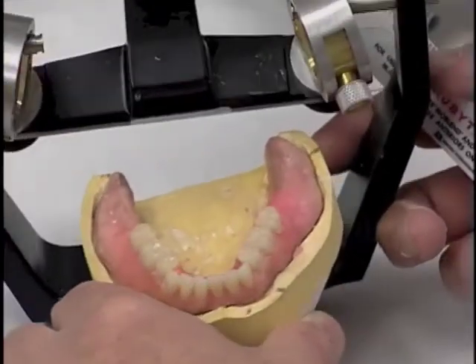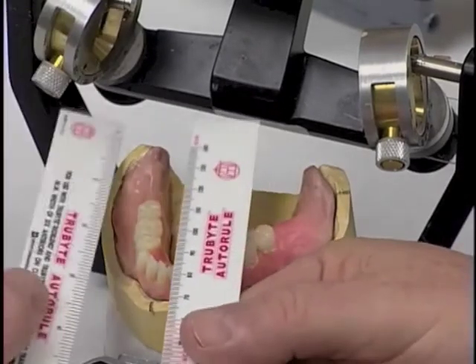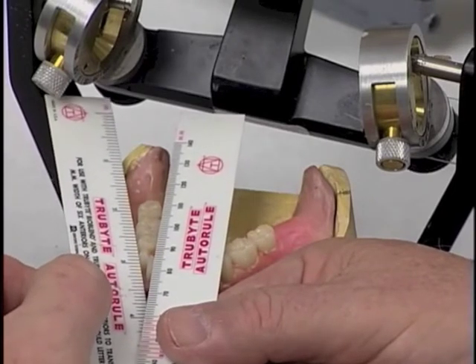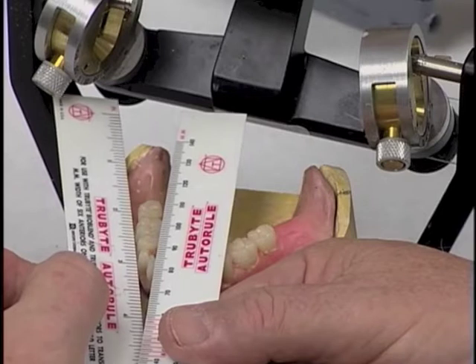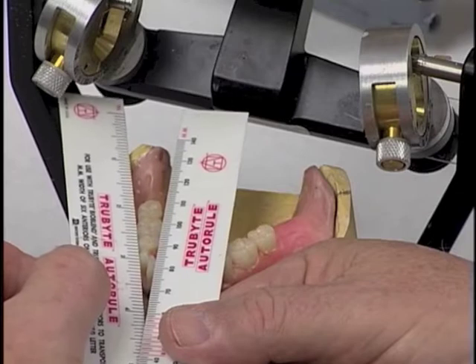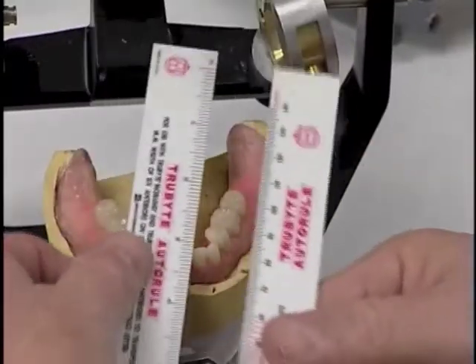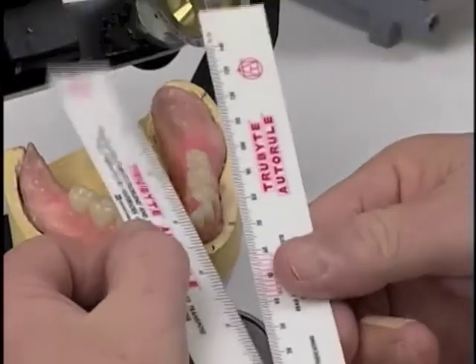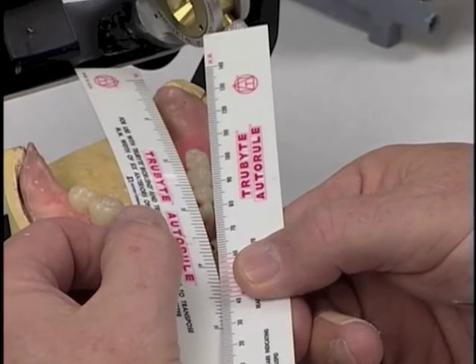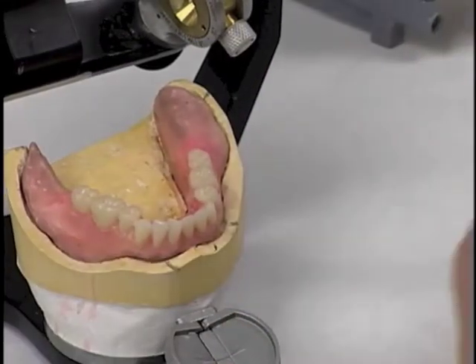The other factor that we wanted to look at is that if we placed a triangle between the canines and the lateral and medial surfaces of the retromolar pad, and from the canine back, the vast majority of those occlusal surfaces are going to fall within that triangle. And if we come around to the other side and do the same thing, we see that the vast majority of those occlusal surfaces lie within that triangle. That gives us a good arrangement for the posterior teeth.